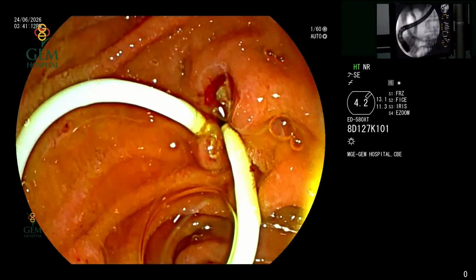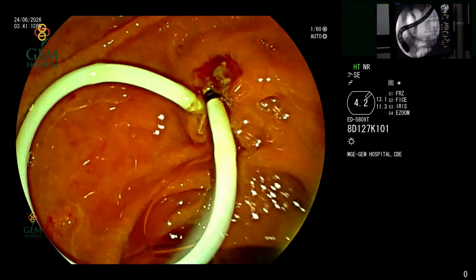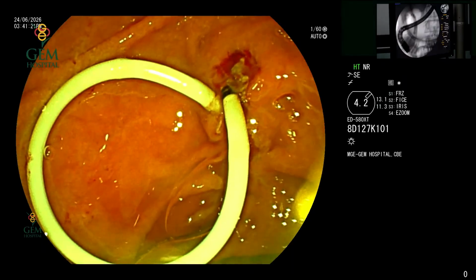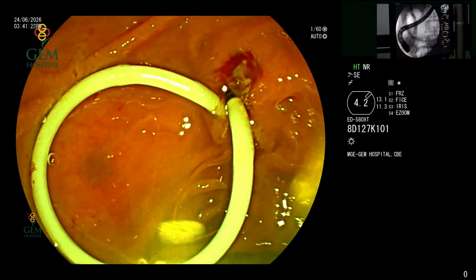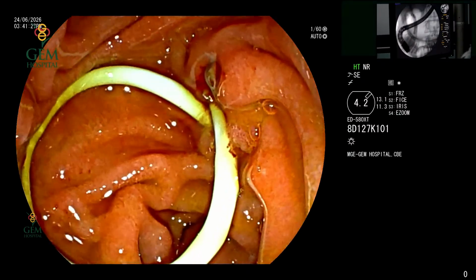This patient had LFT changes but was never jaundiced. Correct. So the stricture could have been the reason, where it was not the stone blocking the whole scenario, but rather the stricture and a small stone getting clogged, unable to pass. But the bile is flowing freely.